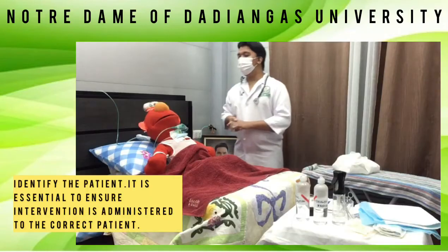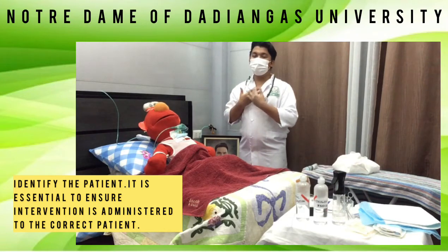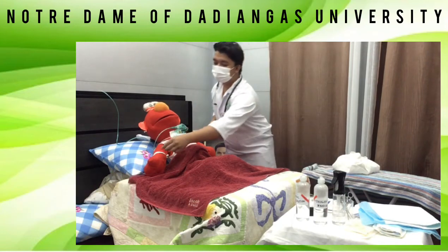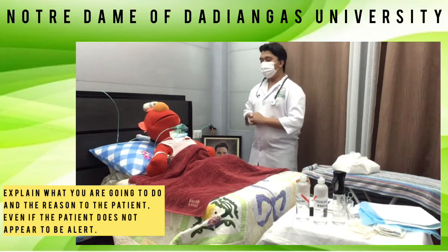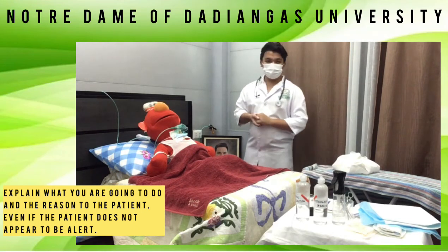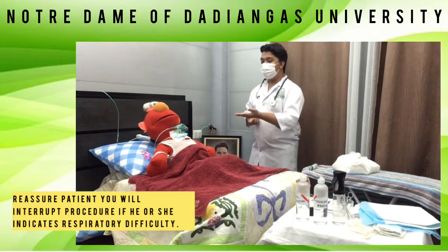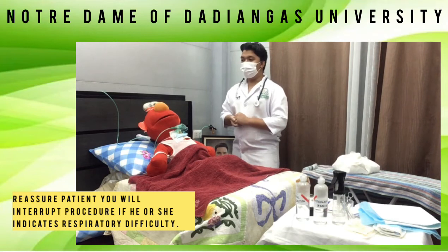Implementation. Identify the patient. It is essential to ensure the intervention is administered to the correct patient. Determine the need for tracheostomy care through baseline information. Explain what you are going to do and the reason to the patient, even if the patient does not appear to be aware. Reassure the patient you will interrupt the procedure if he or she indicates respiratory difficulty.